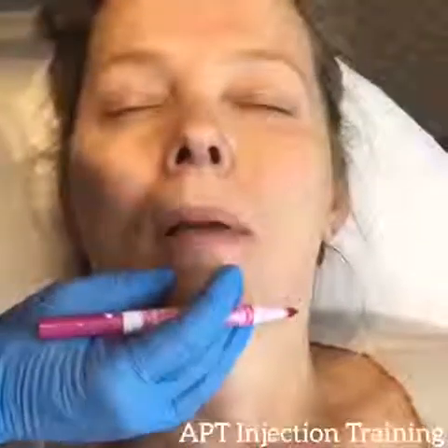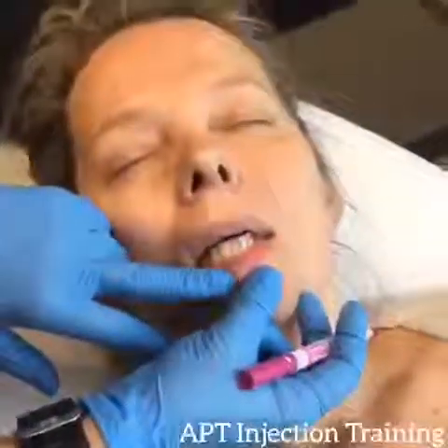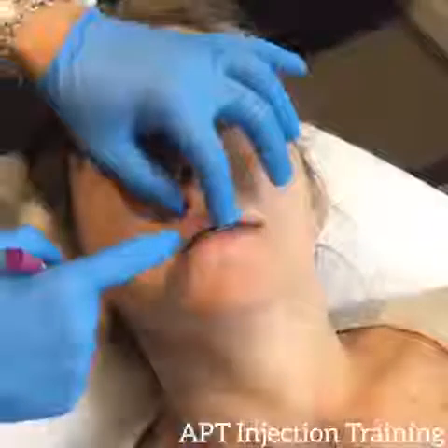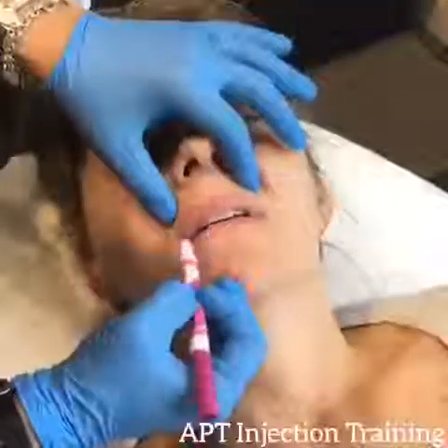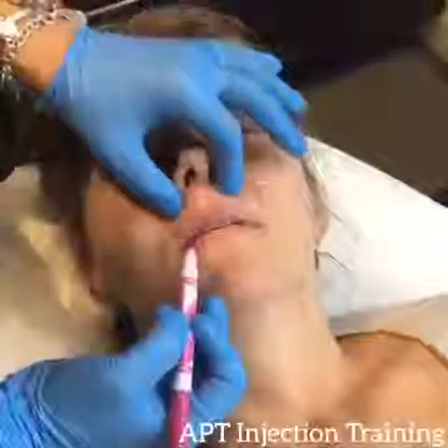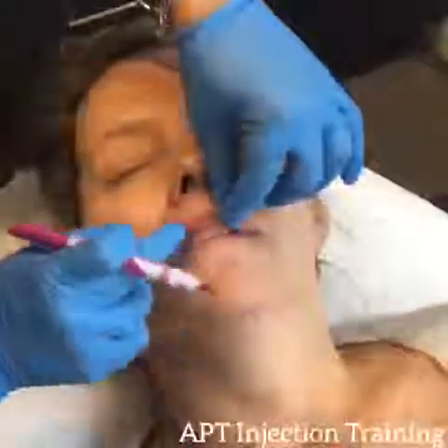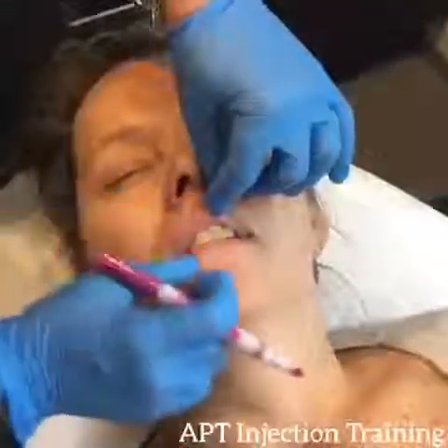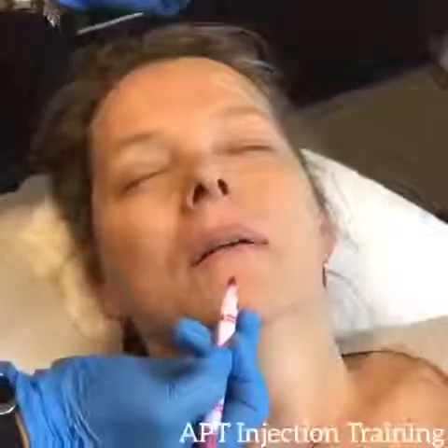Okay, open up just a bit. The wet-dry of her lip is exactly what it sounds like. It's where the wet of the mucosa meets the dry of the outer lip. If you inject along here, then theoretically you can get some very nice eversion of the lip. The issue is that the superior labial artery or inferior labial artery runs just posterior to the wet-dry border.